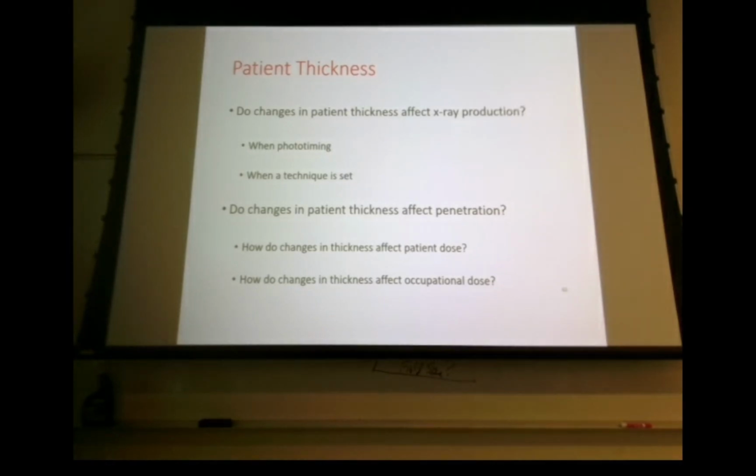So again, now we're back to mock up a patient. A skull's really not going to do this for you, but if you get one of those basins of water and you put maybe 2 inches worth of water in it, make an exposure, and then you put 5 inches worth of water in it and make your exposure, see what happens when you phototime. What you should get is an increase in density, or an increase in mAs. So when phototiming, you don't have to do anything. Remember, your phototimer is the one type of timer that you don't have to control. It controls the exposure for you.